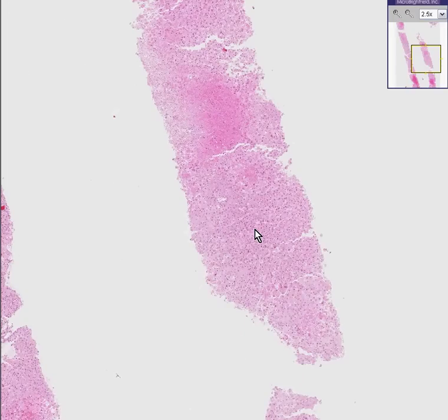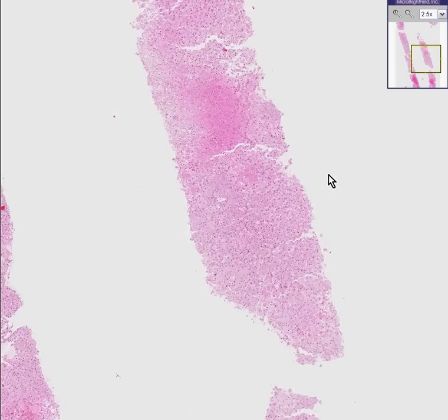You can also notice at this stage even that there really isn't any fibrosis whatsoever. So without fibrosis, you're not going to diagnose cirrhosis.